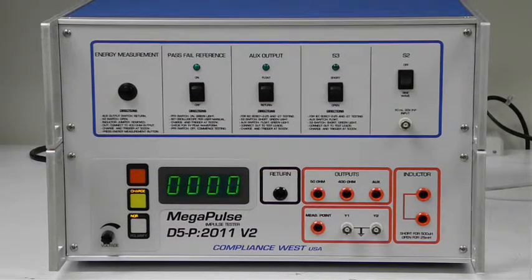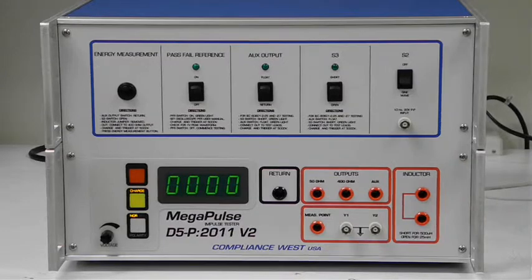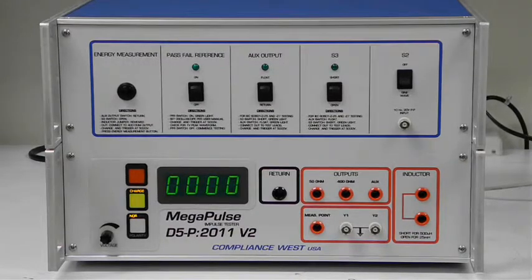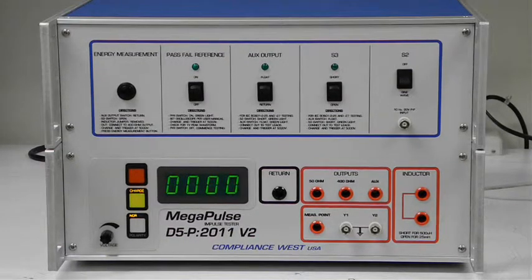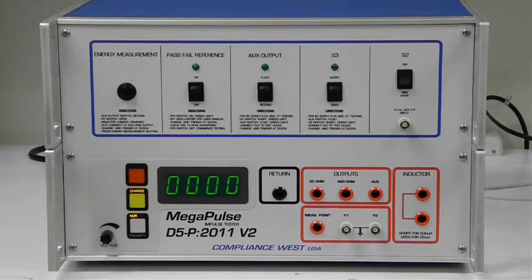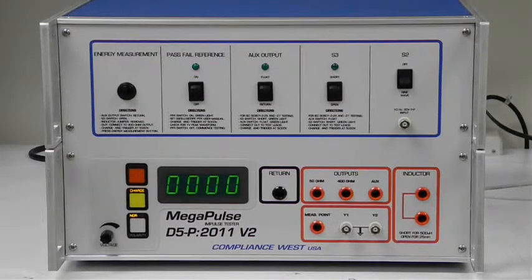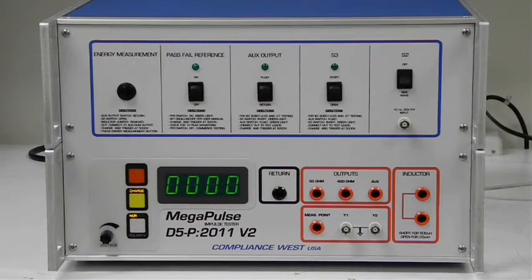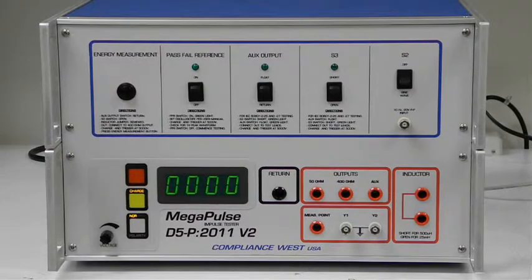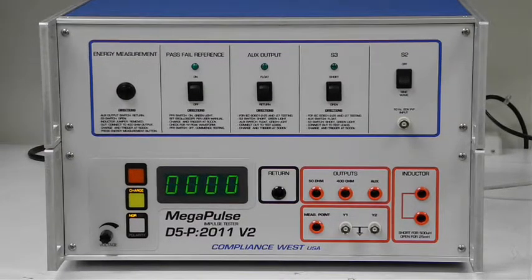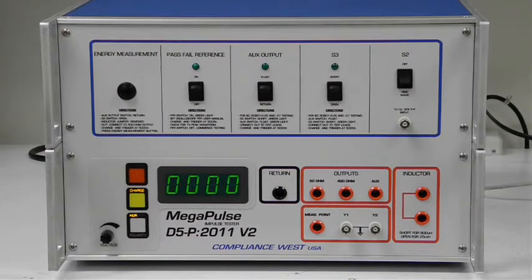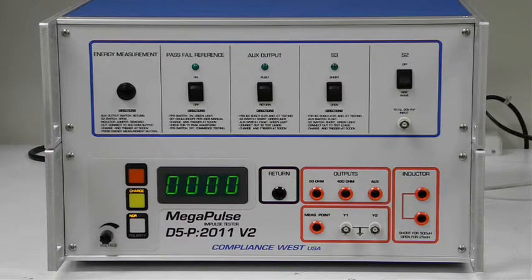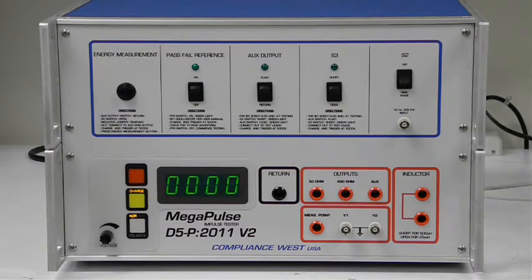Since we do not have any equipment to test, we will demonstrate the test to obtain the reference energy E2 as described in paragraph 8.5.5.2d of IEC 60601 3rd edition.